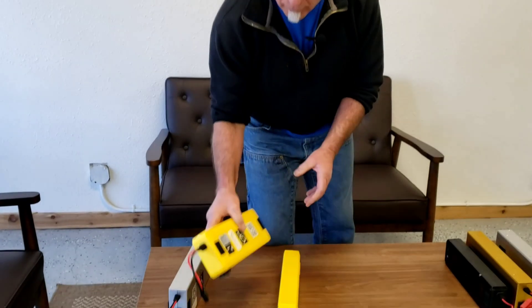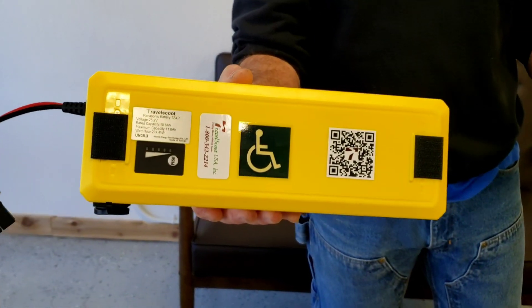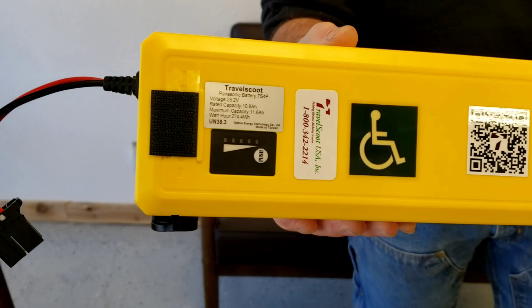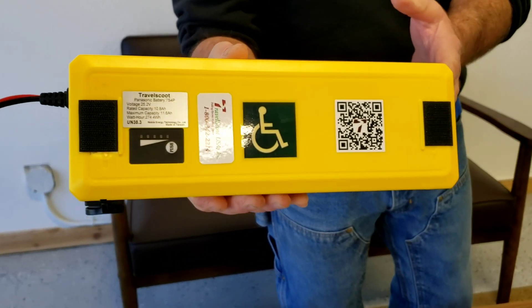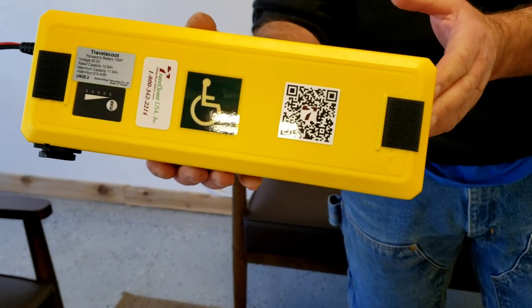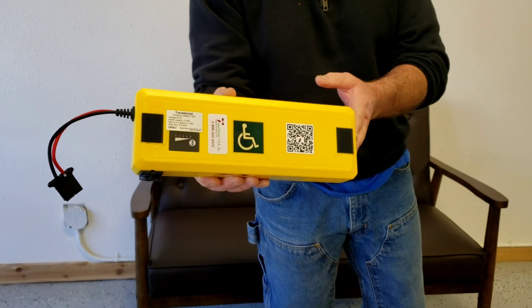Our default battery for the TravelScoot Deluxe is our 274 watt-hour lithium-ion battery. This battery provides about 10 to 12 miles per charge — a little more for that same 200-pound person on level pavement.